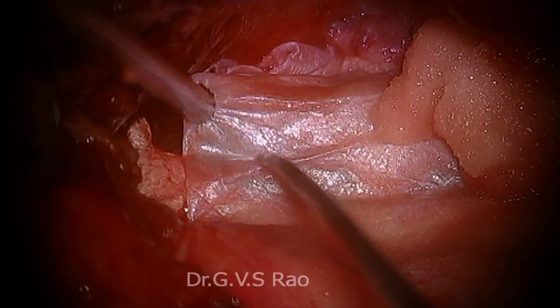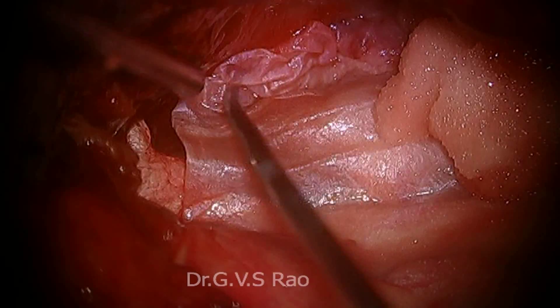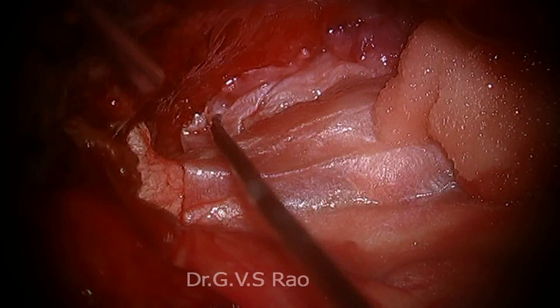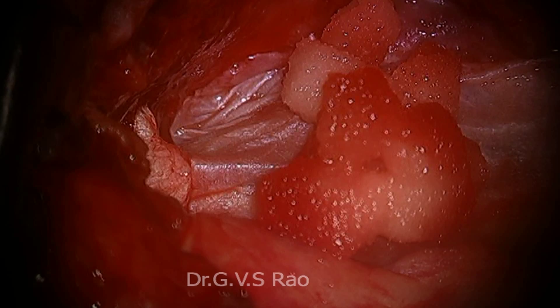This region is getting cover. See this — I told you, once you tuck well, keep it well, automatically the skin will grow. The skin will grow. Now I want to check again here. Final check.